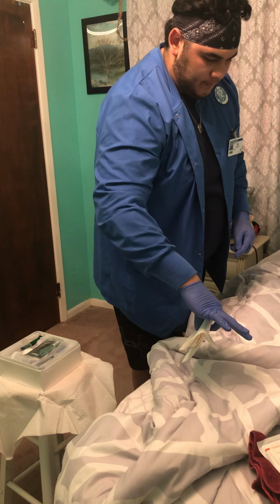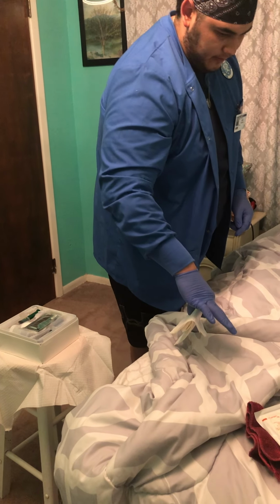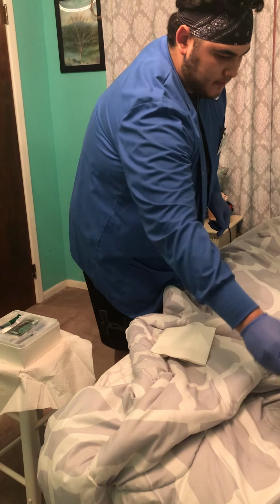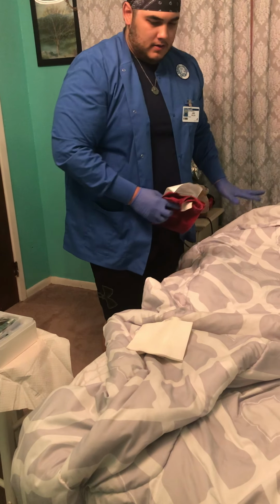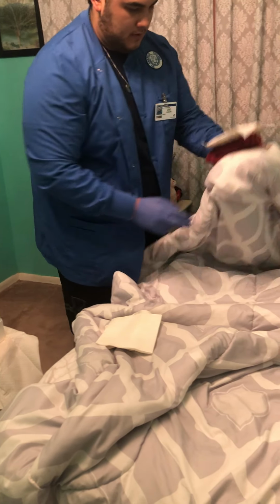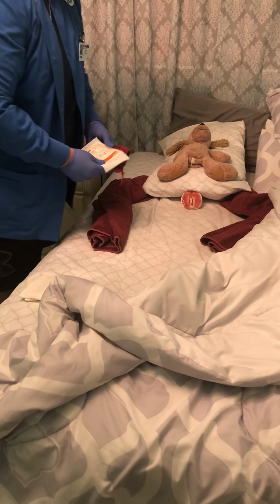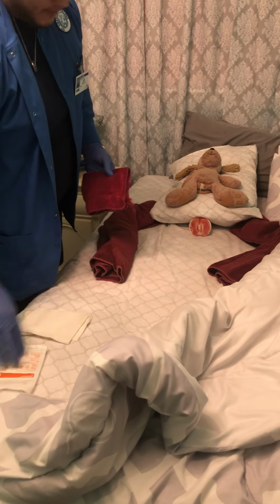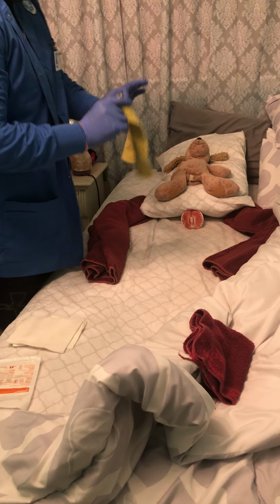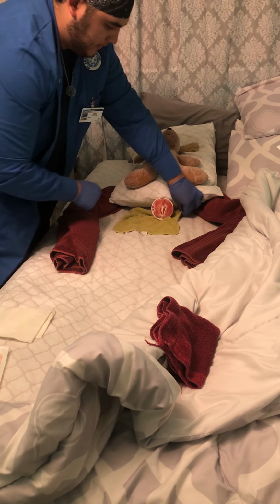And then we're going to set them here. Alright, so we're going to put kind of like a blue pad under the patient just in case we get water or anything like that.